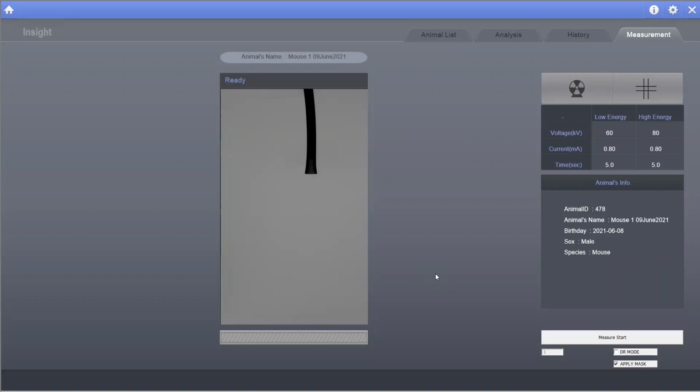At this point, it's a great time for you to enter any questions in the Q&A dialog box that you may have. I'd be happy to address them for you.